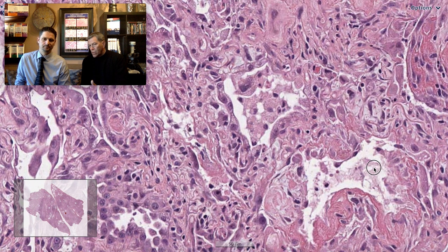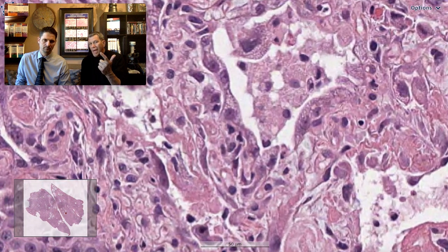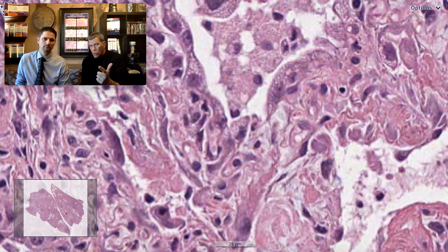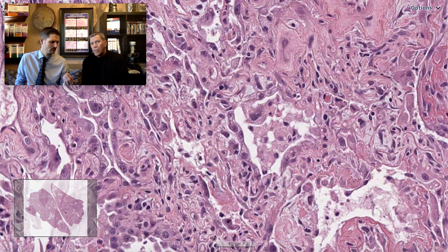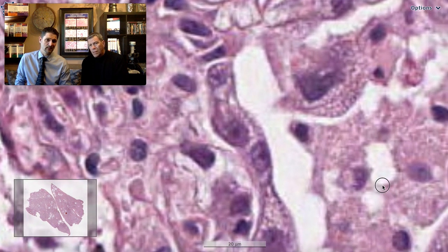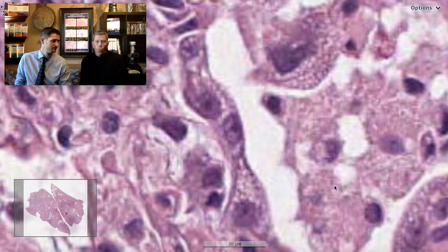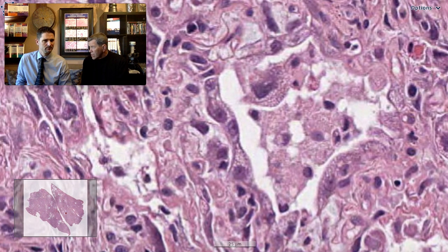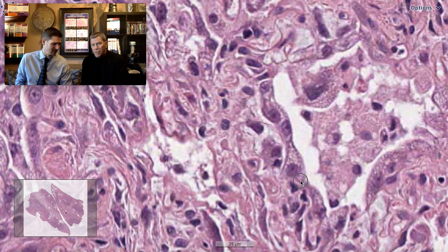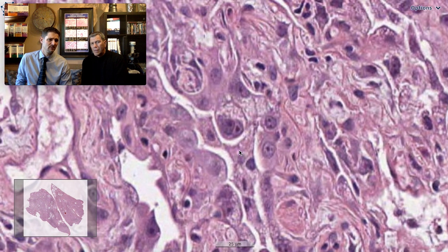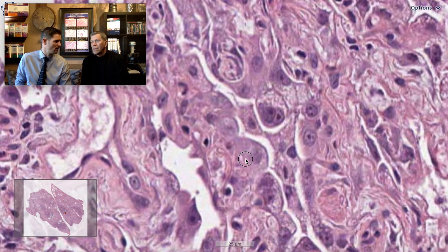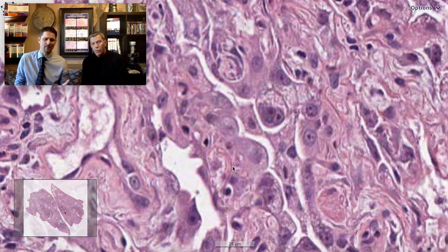What are the classic features of drug reaction that you look for in a biopsy? Metabolic change in the cells of the lung — we're talking about macrophages, epithelium, and the type 1 and type 2 cells. Are there metabolic effects? The classic finding is fine, diffuse vacuolization of the cytoplasm. And I think we have a pretty good example of it right here. So to the clinician, I would say this really looks like a drug reaction — is the patient on any concerning medications? Such as the classic hallmark: amiodarone drug toxicity.